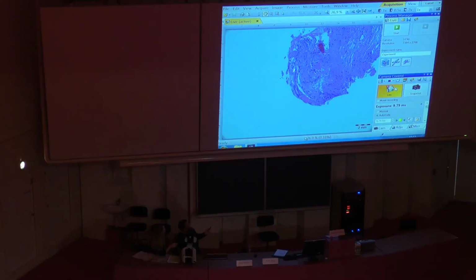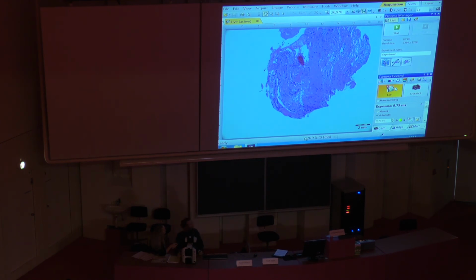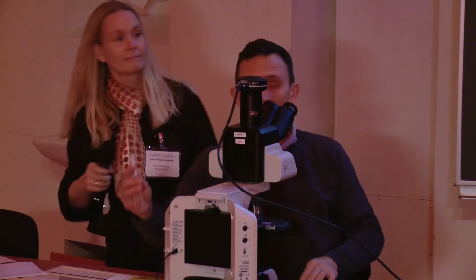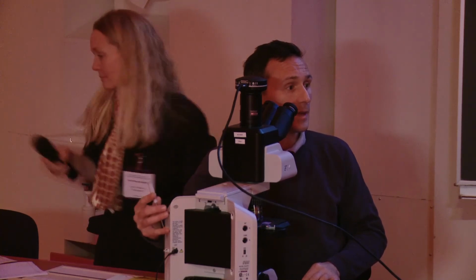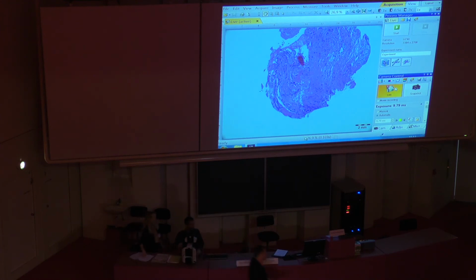The epithelium most of all looks like gastric epithelium more than pancreatobiliary or intestinal epithelium, and thus this is most likely an IPMN of gastric type with low-grade dysplasia. So that's our subtyping. You will do that afterwards.